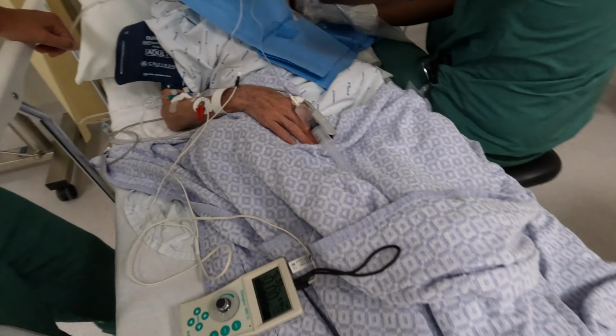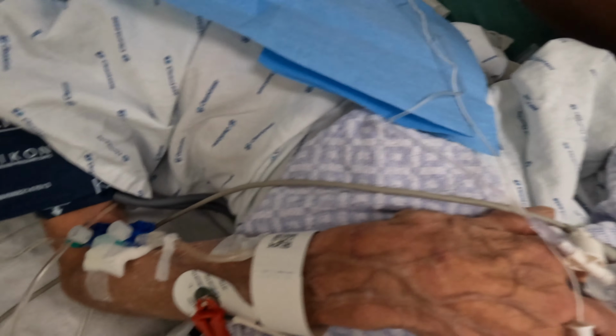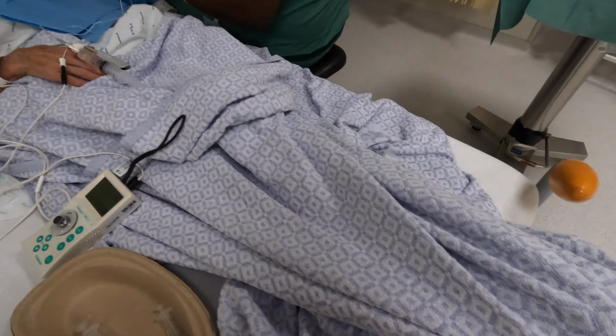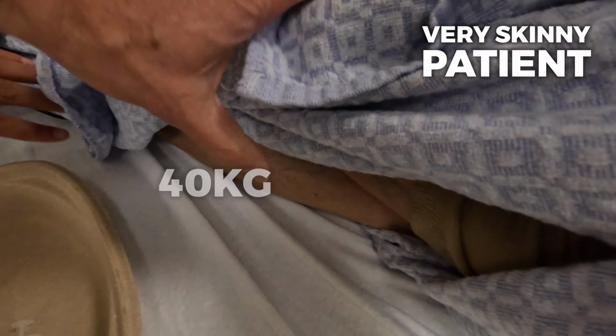Okay, so today we have a very special patient. She has a need for AV-fistula creation. She's in chronic dialysis, but a single look at this patient is enough to deduce that this is a patient with multiple medical problems. And here we have a patient who weighs probably 40 kilos or so.